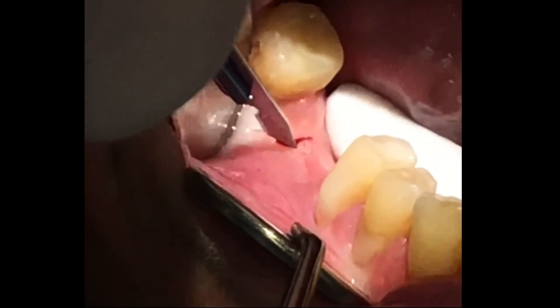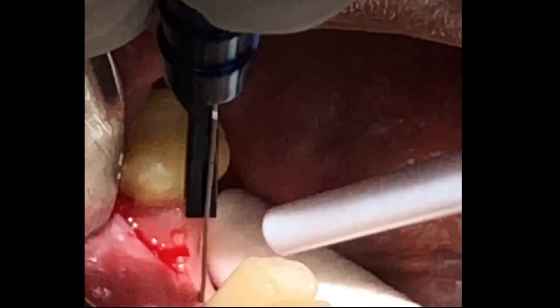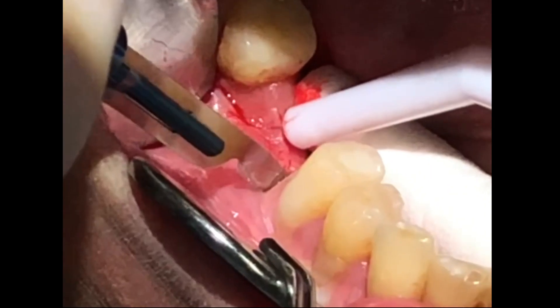The papilla-preserving incision is made to raise a conservative flap, with the objective of displacing keratinized gingiva to the facial of the implant.